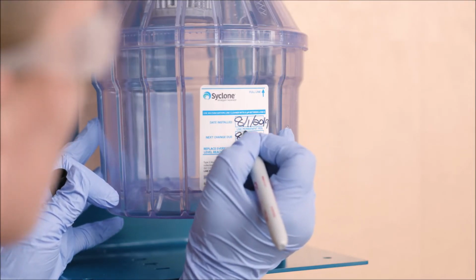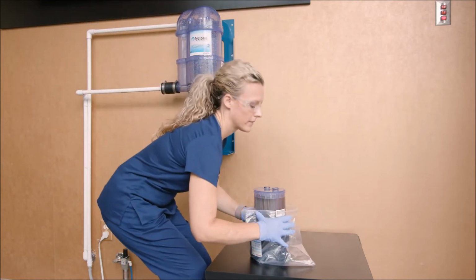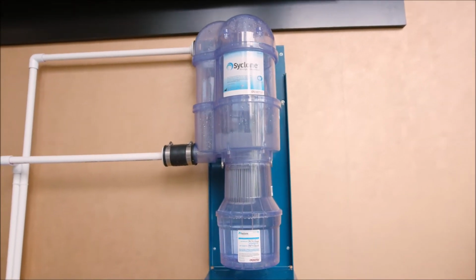And make a note of the maximum change date of 12 months out. Depending on the volume of activity, the unit may become full and require a changeout before the 12-month time frame. Once connected, the water will start flowing through the new canister.